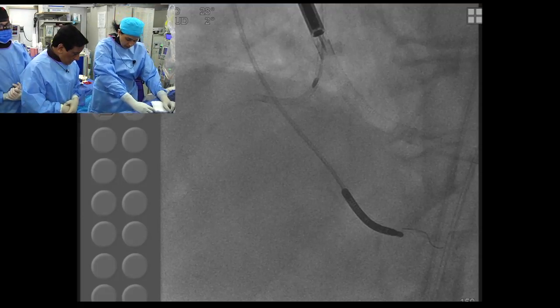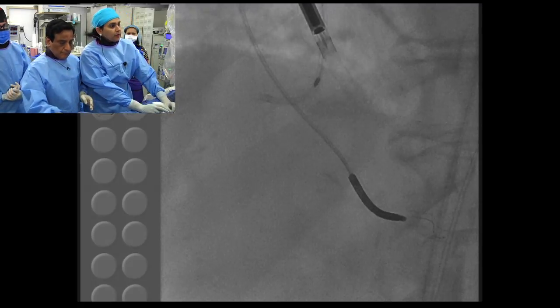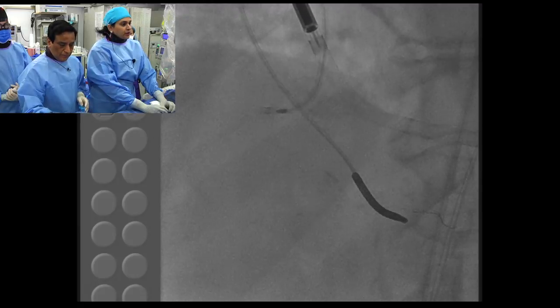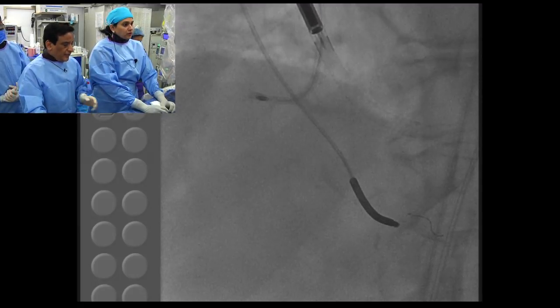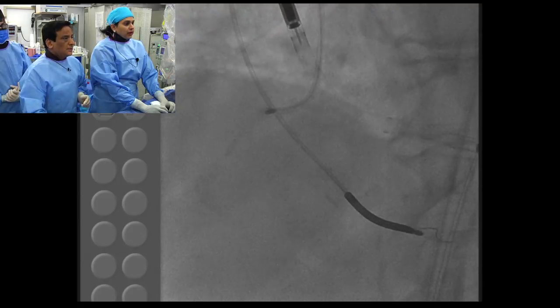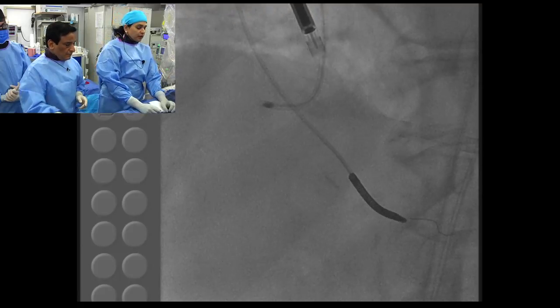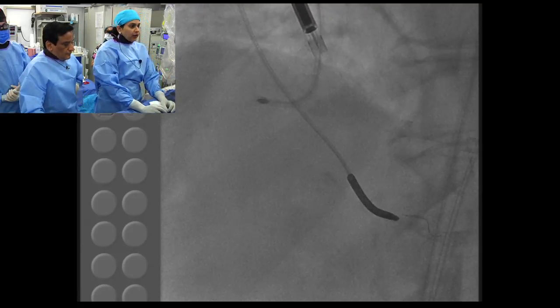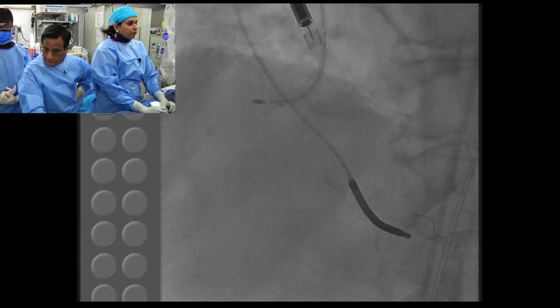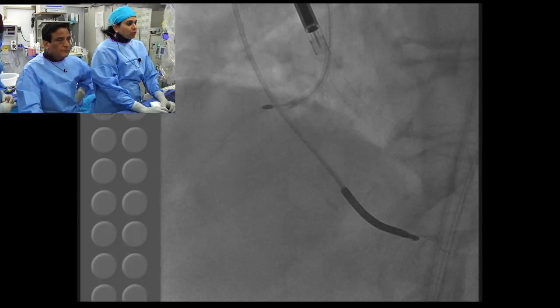So now what is going on here, we have the rota burr. You chose 1.5 or 1.25? Yeah, 1.5. Okay. Right now we are at 1.5. Of course, the concern was creating the gutter effect in this tortuous vessel, but then we'll see. I'm trying to get the burr in. So if he has a push-pull, six French. Okay. If we have trouble getting the guide, as soon as I try to bring the burr in the proximal part of the RCA, you start seeing the guide pushing out.